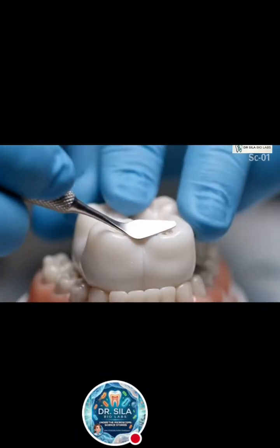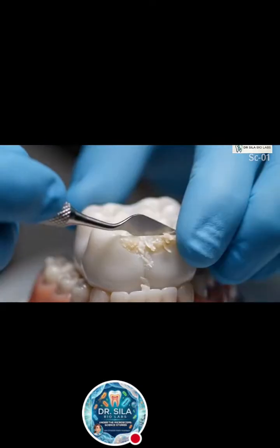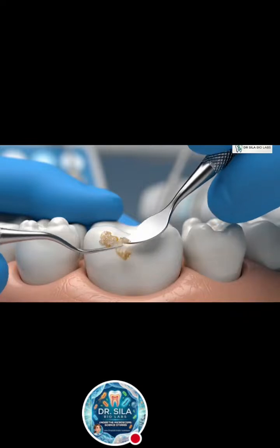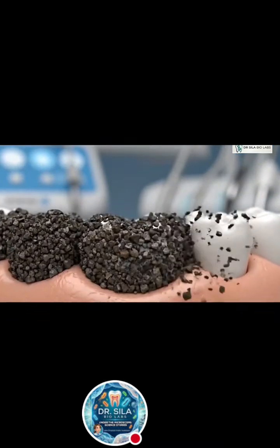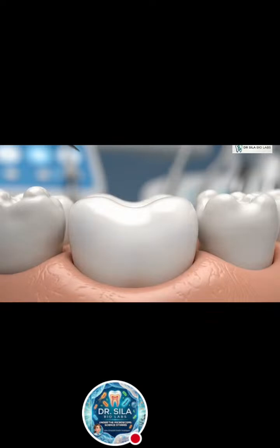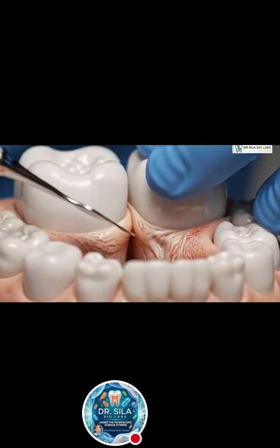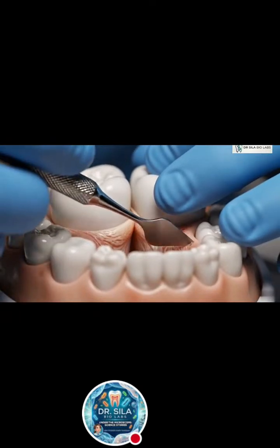The curved design allows the instrument to adapt to root anatomy. This helps remove deposits that may remain after ultrasonic scaling. Even tiny remnants of calculus can be detected and eliminated. The goal is to leave the root surface as clean as possible. Hand instruments provide excellent control in difficult-to-access areas. They are especially valuable around complex root structures.